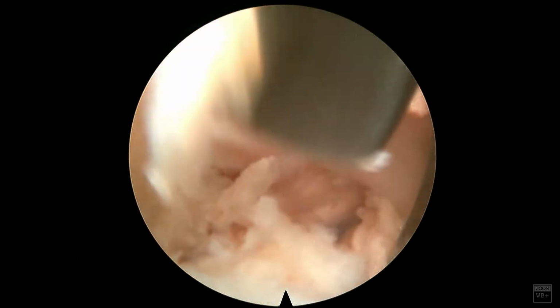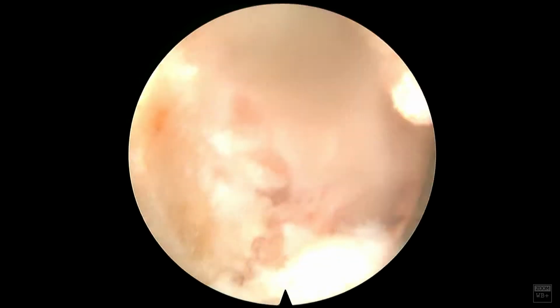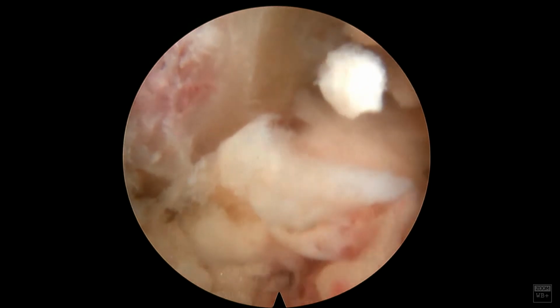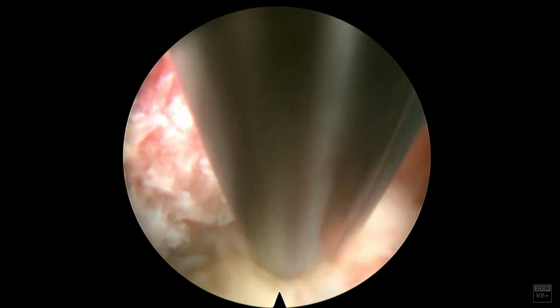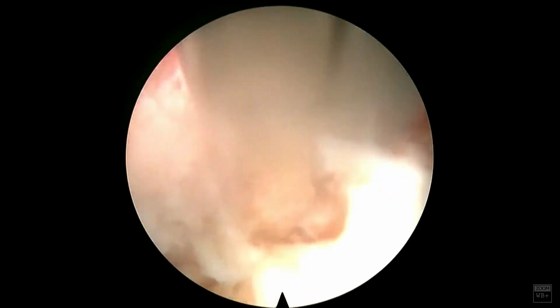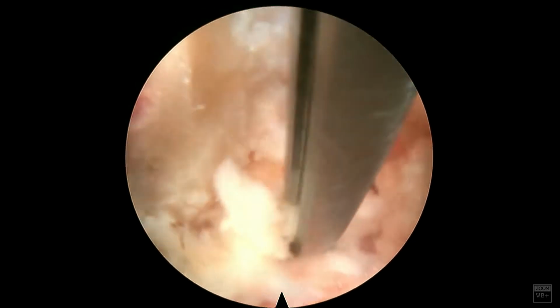But right now, my goal is to really decompress the foramina, get a good idea of where I'm at, maybe visualize the nerve, and visualize the disc space. Once I do that, then I can see what else I need to decompress. Here I almost got the ligament attachment off, and this is going to really open up our window for everything.